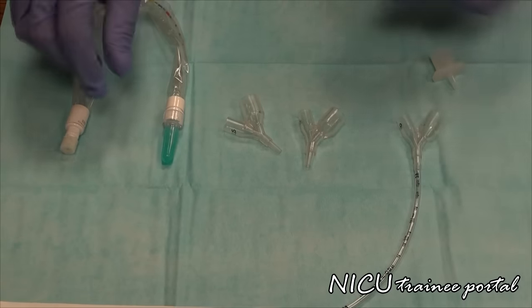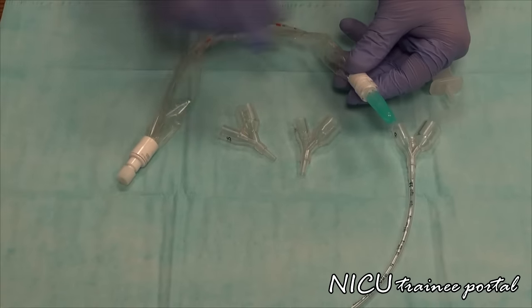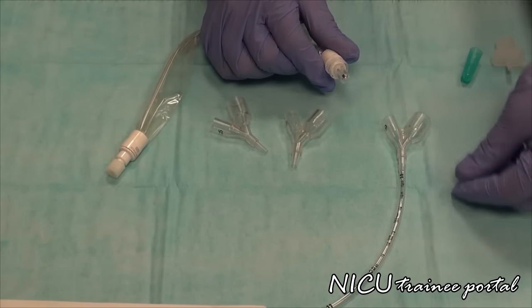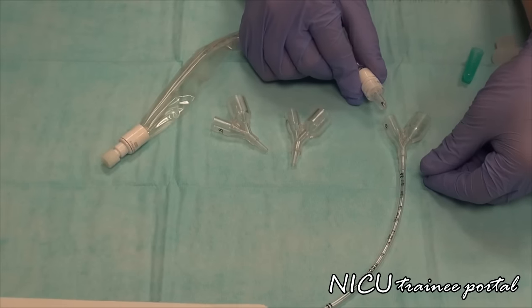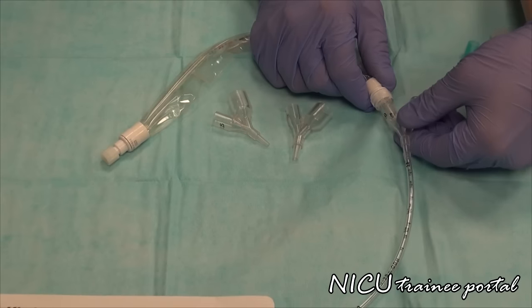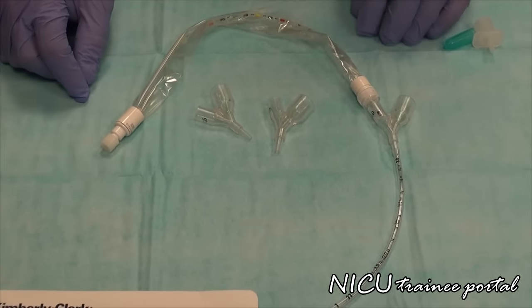From here, we take our 5 French catheter, remove the blue cap, and this catheter goes into the smaller of the two ports. And now you are ready to administer your surfactant.